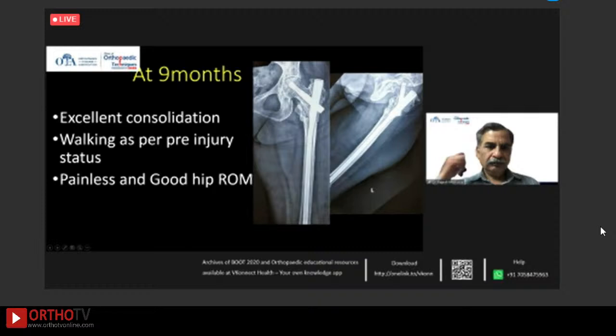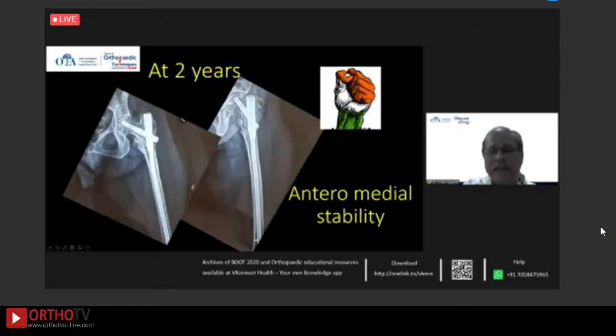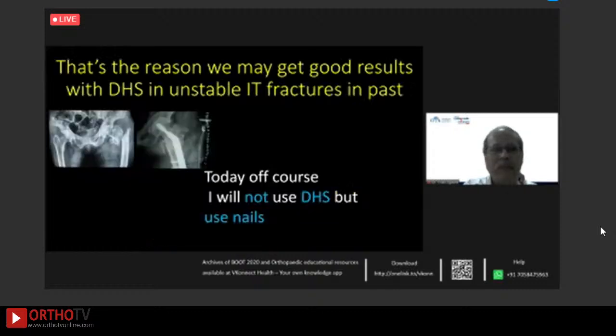You can see she has consolidated very well, walking as per the pre-injury status for almost 4 months. She has an excellent range of movement, and you can see the lateral wall formed by itself. You really don't need to do anything for this lateral wall, provided you have a good anterior medial stability. And this is at 2 years, you can see a very well consolidated fracture. It was the anterior medial stability that is very important. That is what saved us.